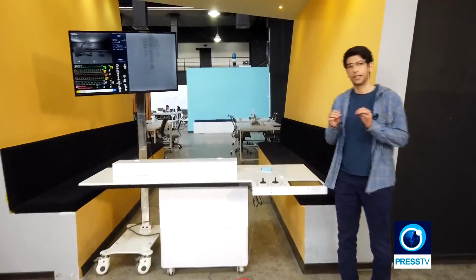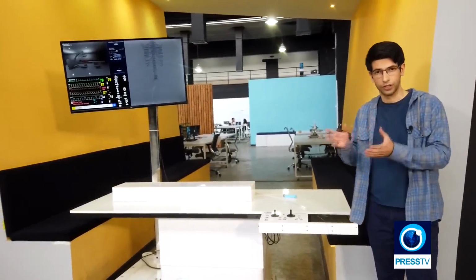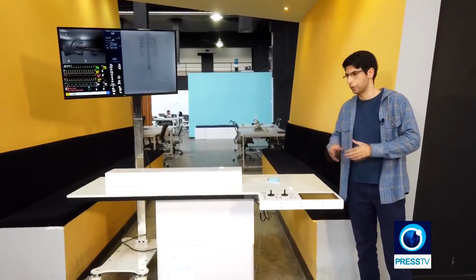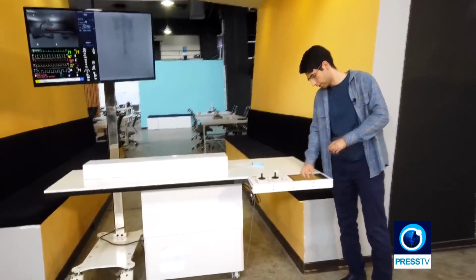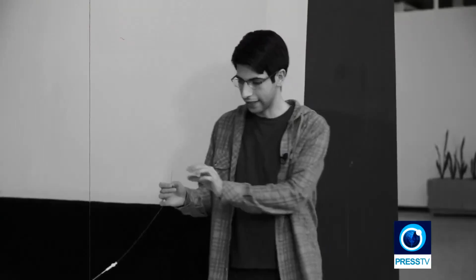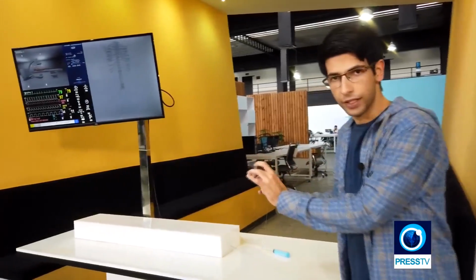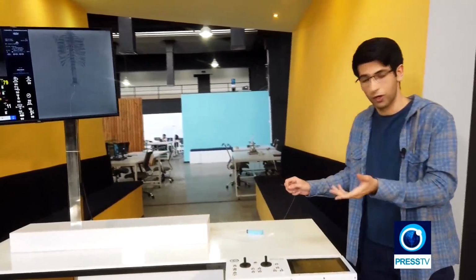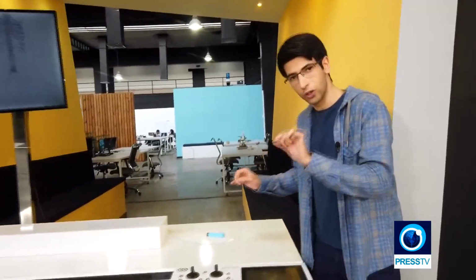If I'm going to explain what an angiography simulator does, I also need to explain what actually happens in an actual angiography procedure. Why we do angiography is to diagnose clogged arteries as a result of plaque buildup. So what happens is that first we insert this guide wire and the end into one of the arteries in the patient's leg or their arms. We insert it into those arteries, and the end of this guide wire needs to be very flexible so as not to damage those arteries as it's twisting and turning inside the patient's artery, until it reaches the coronary artery.